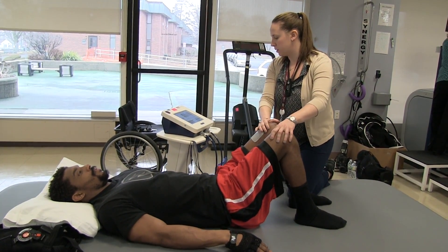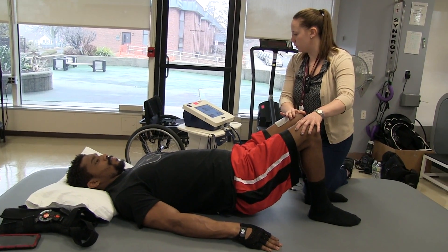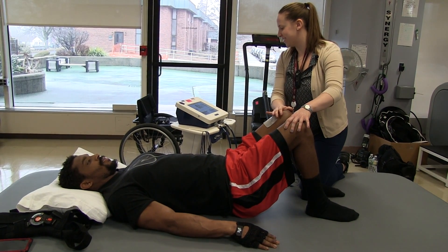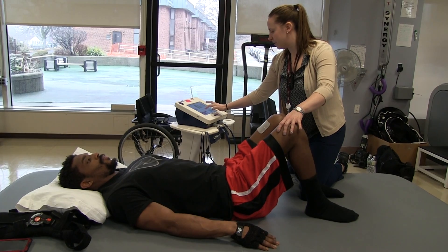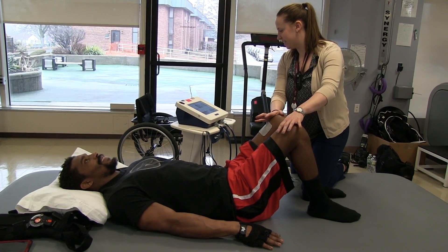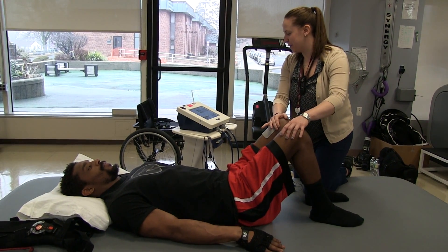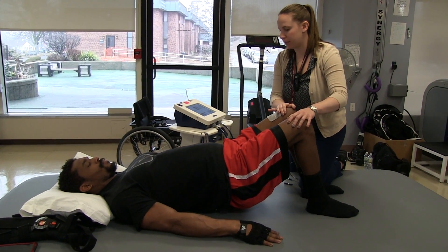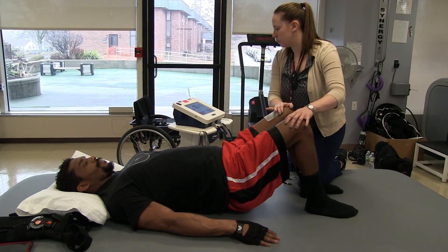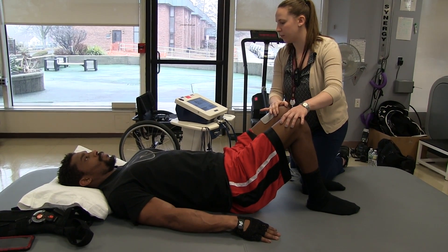So up. Squeeze. Nice. Hold it. Good. And down. Slow. Ten of those — it's all about the control and the endurance of these muscles. Up. Squeeze, squeeze. Lift them up as high as you can. Good. A little longer. And down. Controlling on the way down.